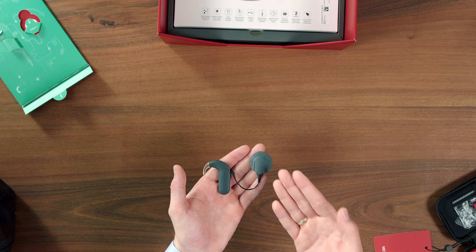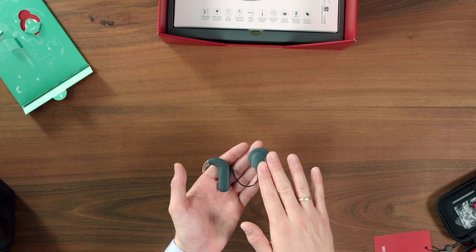This Sonnet 3 is in a sleek anthracite color. You can also get design covers to make the coil cover match your style.